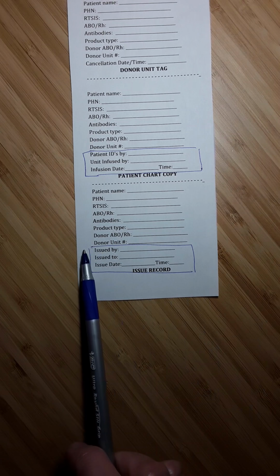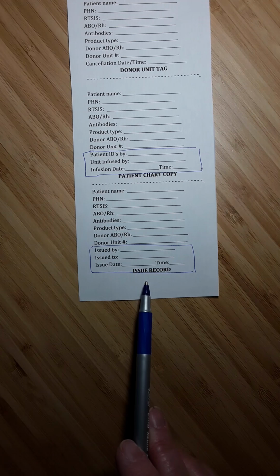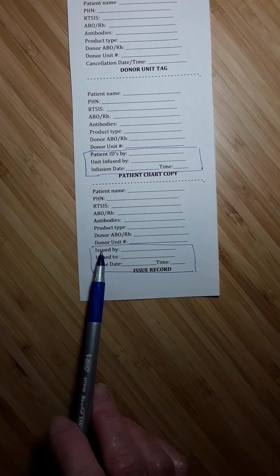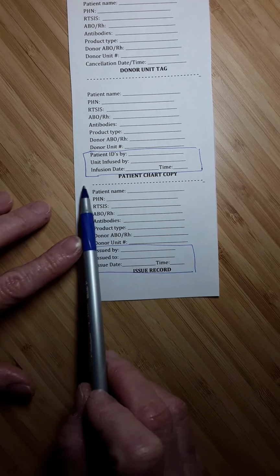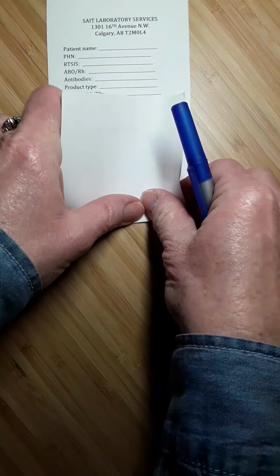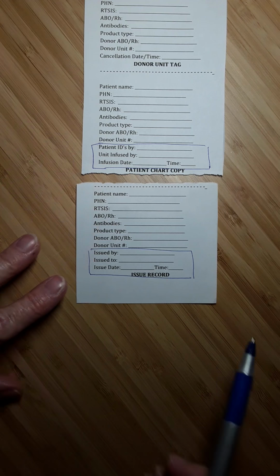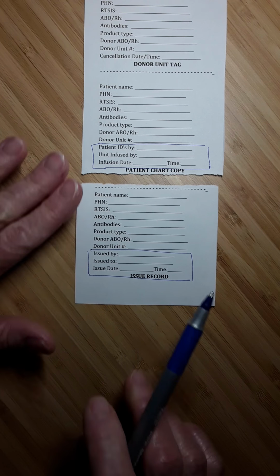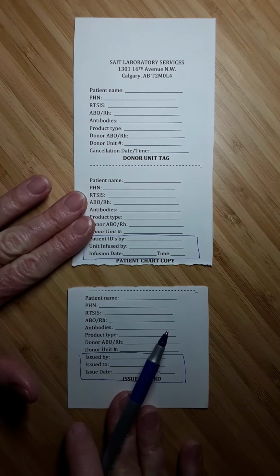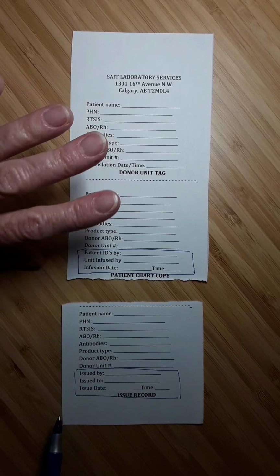This portion is not filled out until you are ready to hand over the product to whoever it is that's picking it up. So do not fill this out just because you did the type and screen. You might not be the one who is issuing the blood. Once this portion is filled out, this part of the tag is ripped off. So I'm just going to fold it and rip it on the line there. So this portion of the tag now is the issue record, and the person that's come to pick up the blood will now take the unit of blood with this portion of the tag attached, and they'll be gone.